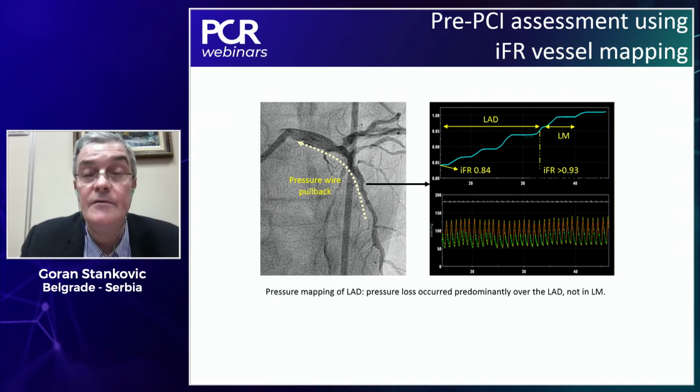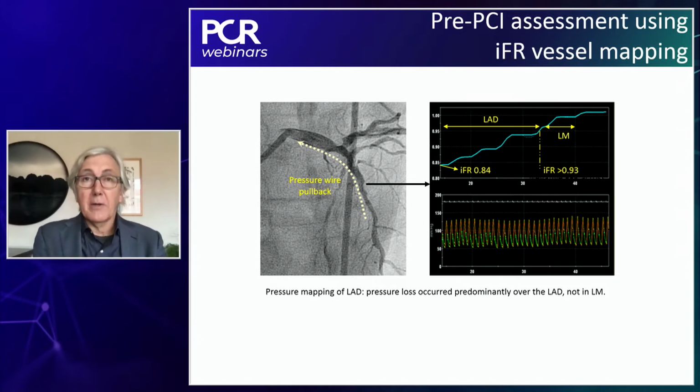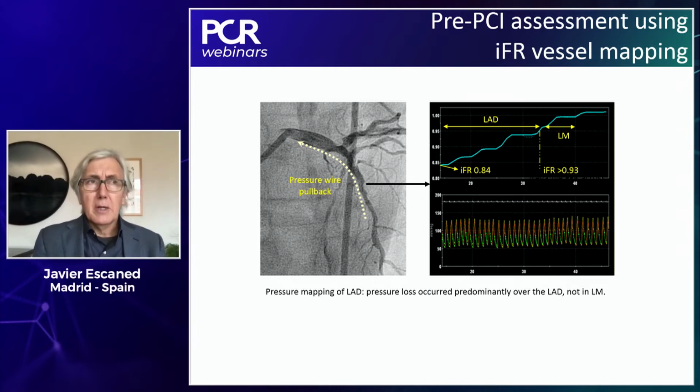Maybe iFR. So this goes in line also with your current discussion. Yes. Hi, Carlos. So this is a very important question, of course. I think you can perfectly do it with intracoronary injections of adenosine. The only thing you have to make sure is that there is no spillover of the adenosine in the coronary, in the Valsalva sinuses, that you are properly engaged.